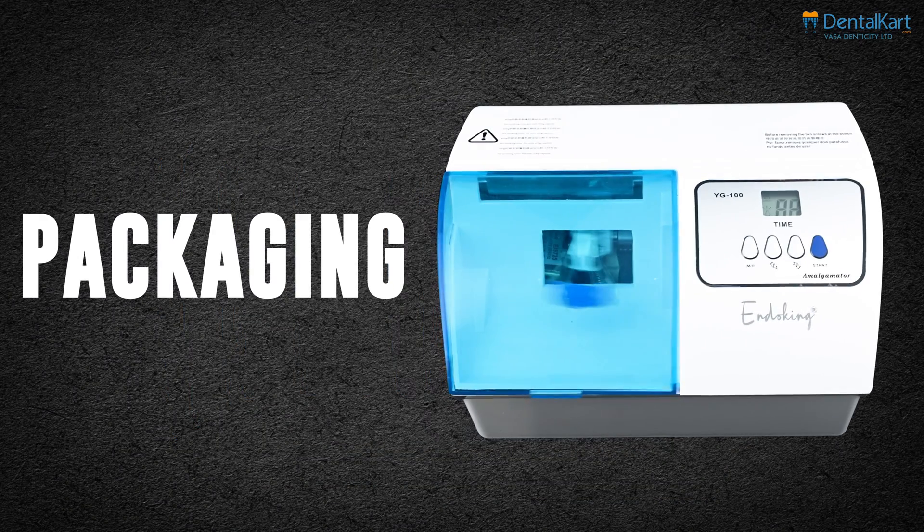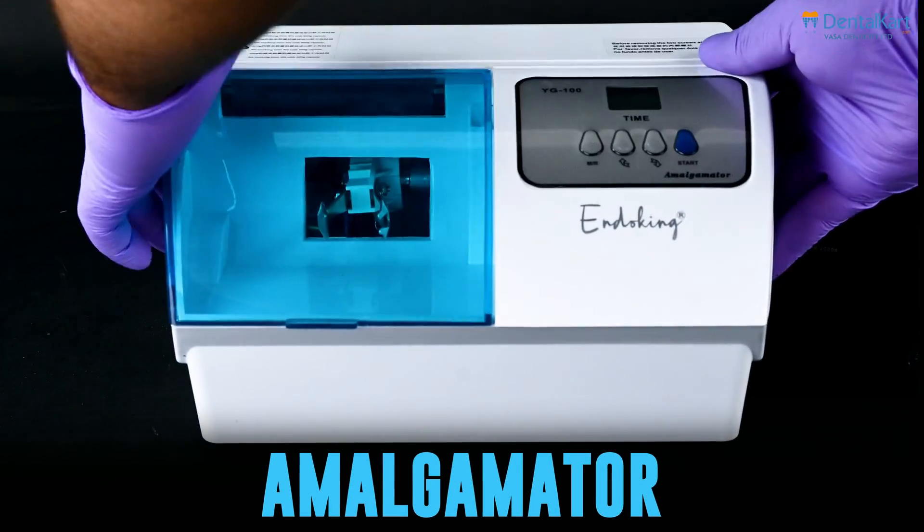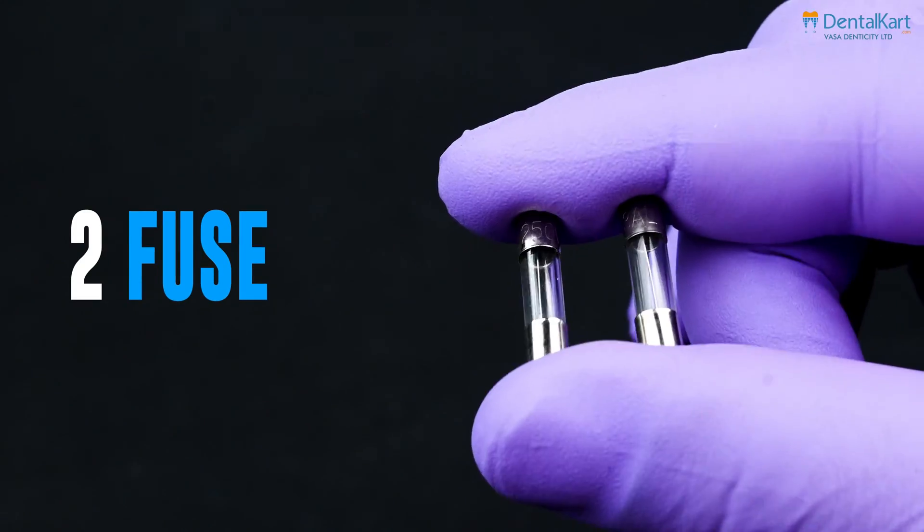In its packaging you will find an amalgamator, an instruction manual, and two fuses.